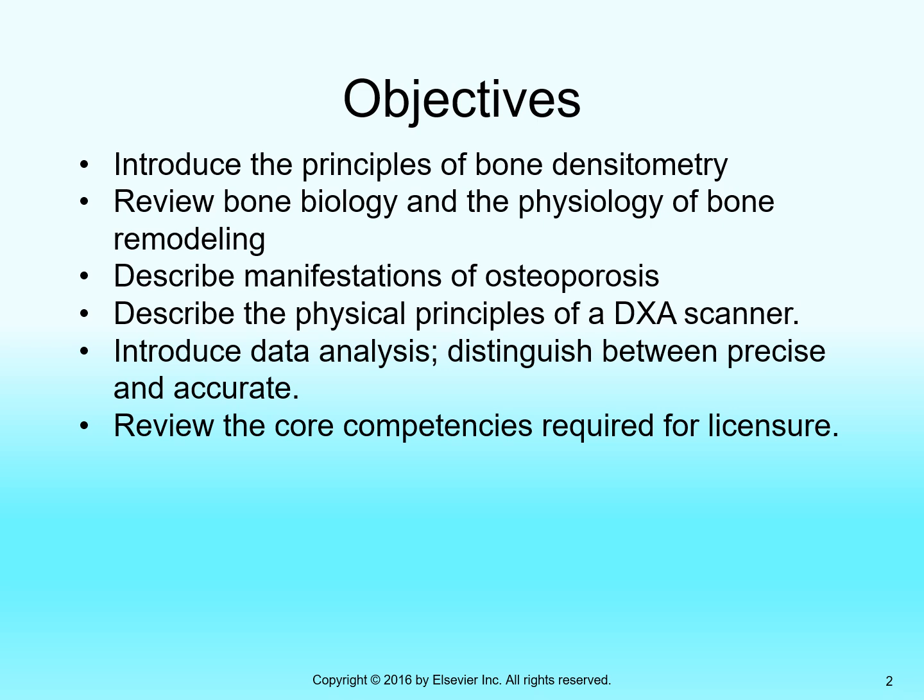So I'm going to talk to you about the exam itself. Most of the time when you do a bone densitometry test, it's the same for every patient. So they measure bone density at particular anatomy from particular vantage points, typically the lumbar spine from an AP or a PA, and then the hip from an AP hip.